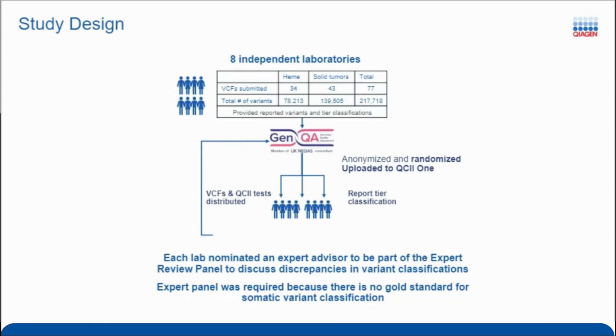And I'm going to add to that, certainly we found with some of our discrepancies that they would be resolved by the person aspect of QCI1, rather than the computer algorithm, by submitting it for that extra level of interpretation by individuals. I think that's a really valid way of doing things, because computers can't tell you everything, but you get better if you can send it off for a more curated individual human approach, and the combination of both gave the best answer, I think it's fair to say.